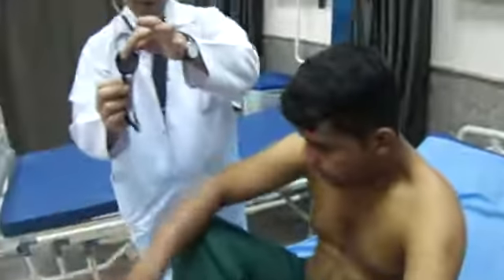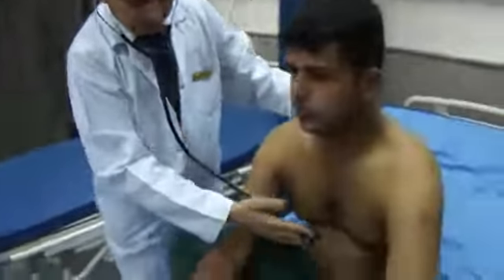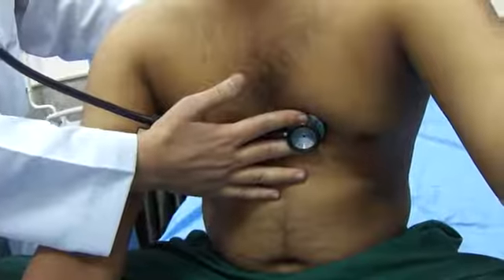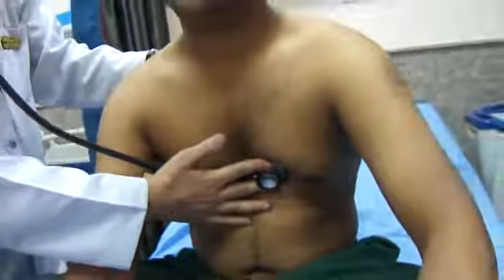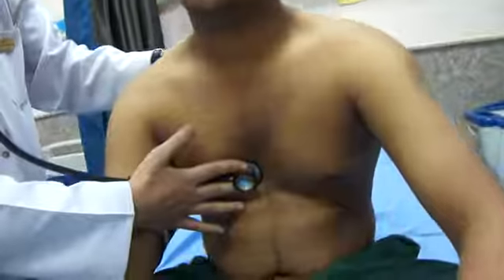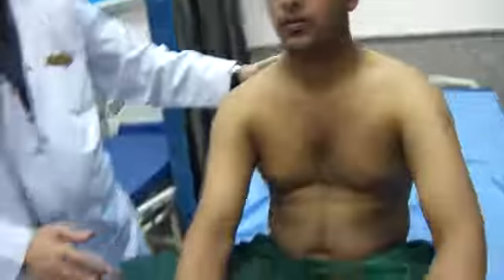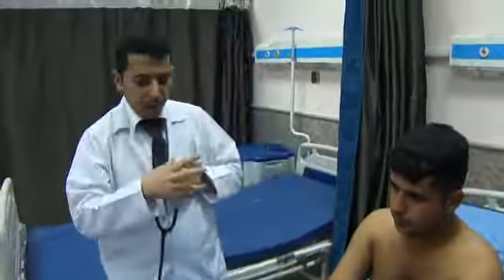Then I'll turn my stethoscope to the diaphragm and check for the presence of the diastolic murmur of aortic regurgitation at the left parasternal or right parasternal area. This is really the basic principles of the auscultation.